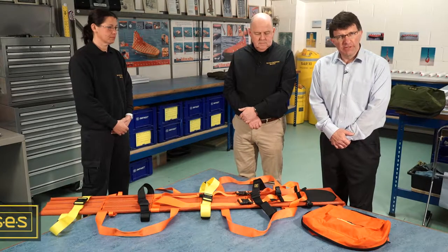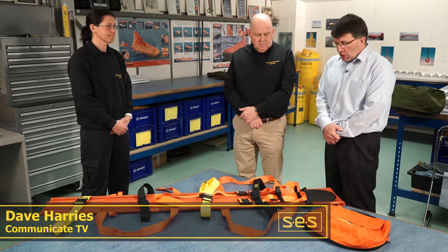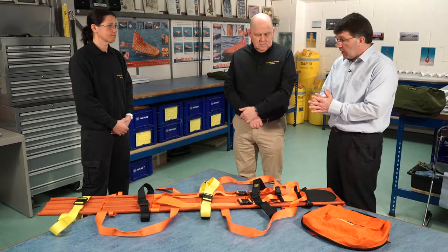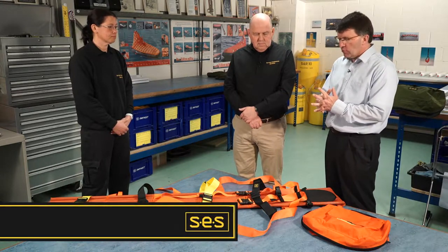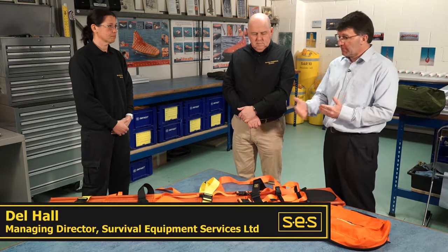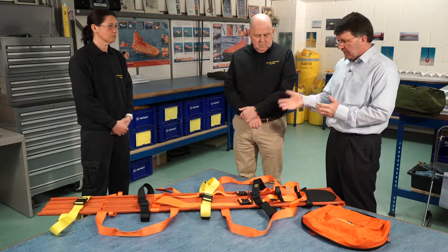I'm here at Survival Equipment Services with Dale Hall, the Managing Director, and one of the technicians, Becky. We're here with the remarkable portable stretcher that they've developed. One of the important things about these stretchers is you've got to be able to put them away after they've been deployed, so Dale and Becky are going to show us how we do that.